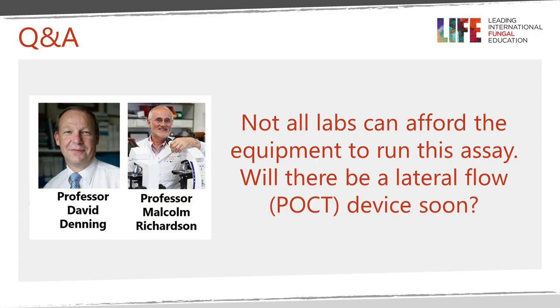That's an interesting question. We discussed this in Kampala at our Central Diagnostics meeting about 2 years ago, and one of the key Japanese inventors of the original glucan assay was there. It's probably very difficult to do a lateral flow assay for several reasons. One is that you're dealing with extremely small amounts of glucan. Secondly, you've got an open assay in the sense that the cassette and the filter paper, while it may be sealed initially when it's manufactured, is then opened to the air. And we know that glucan is present in a lot of dust and other external environments.